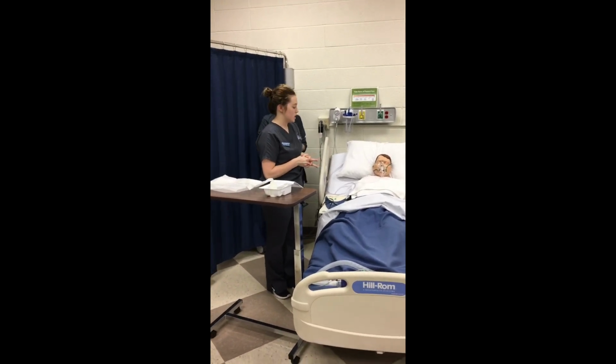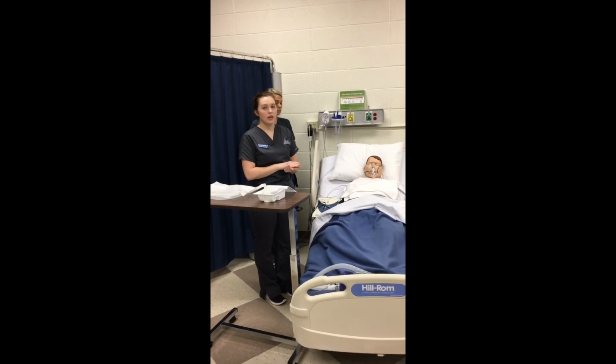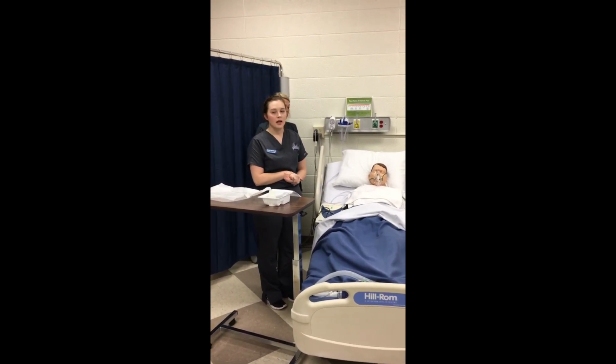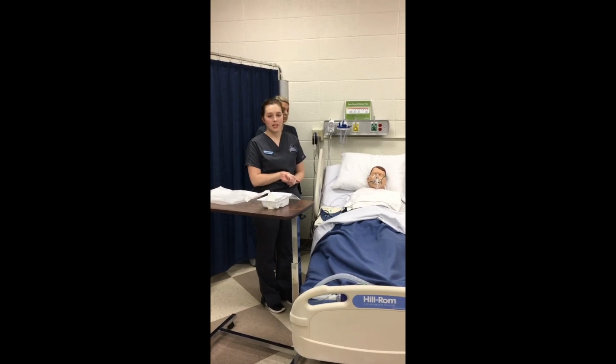I'm going to ensure that my patient is comfortable and all safety measures have been completed, and then I will document all the data I've retrieved.